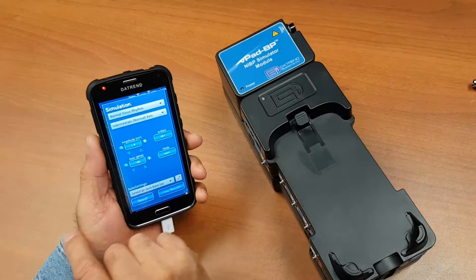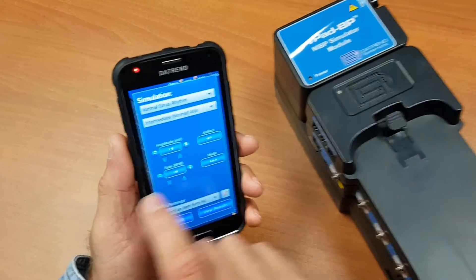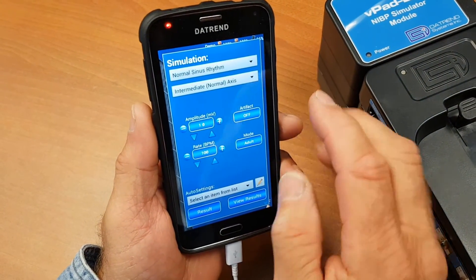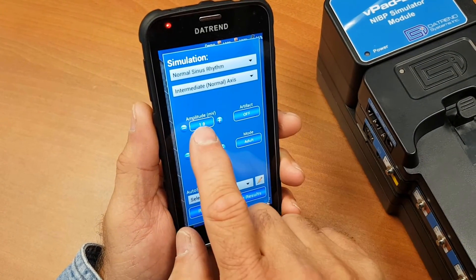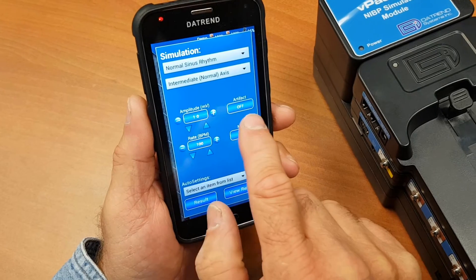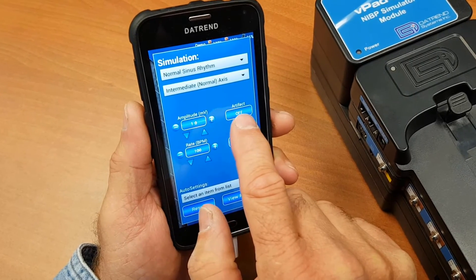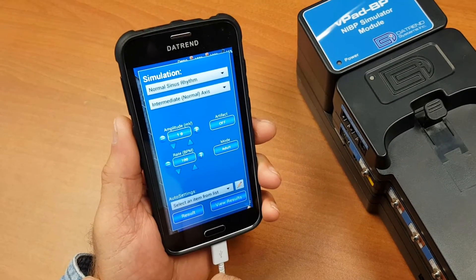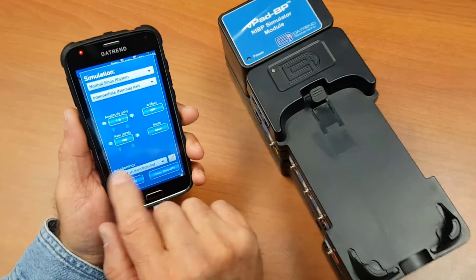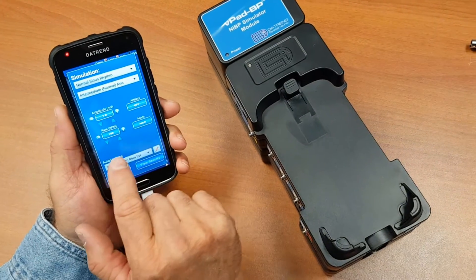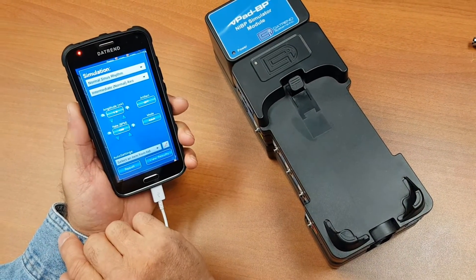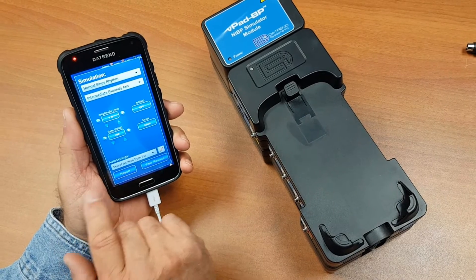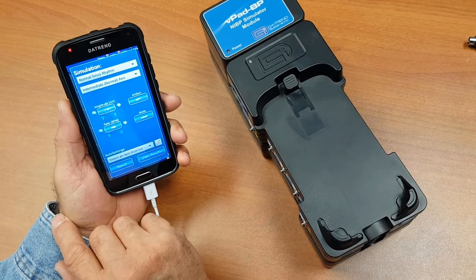If we go to normal sinus rhythm, you can adjust the axis, the amplitude, the rate, and artifacts, as well as whether you're in adult or neonatal mode. Once you've made a series of settings for this particular ECG simulation, you can then save them as an auto setting.